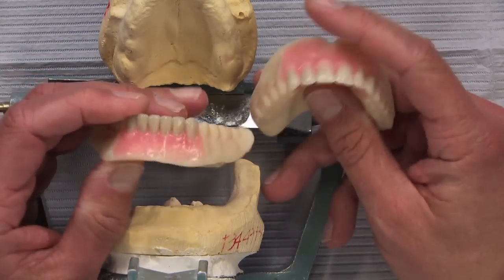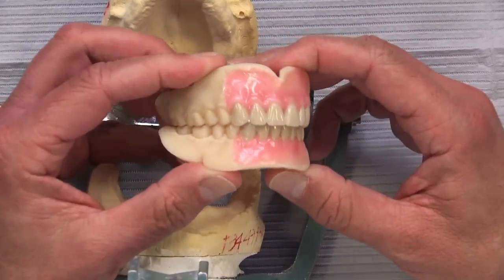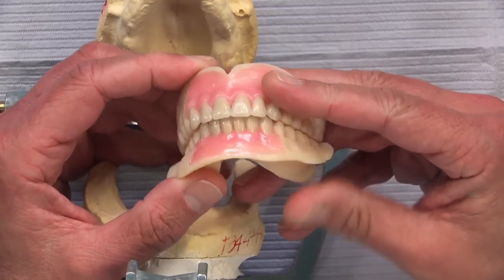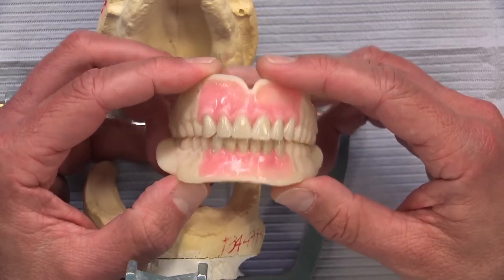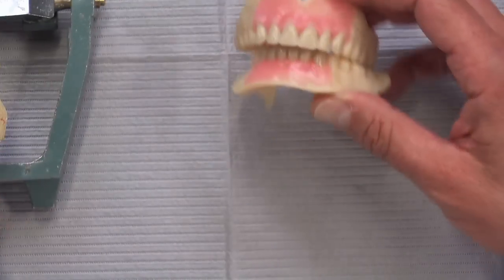You get these back, try them in, and they're going to fit the same as the final denture — so you should not need any adhesive, maybe a little on the lower depending on how much ridge is left. Then you and the patient verify whether you like the position of the teeth, or change anything that needs changing, and then send it back to us.